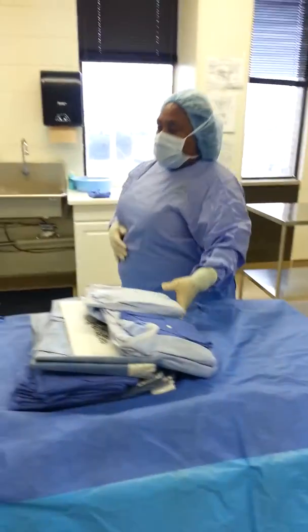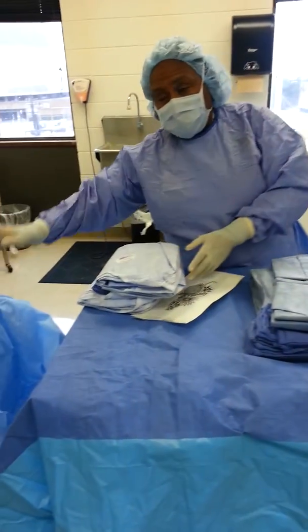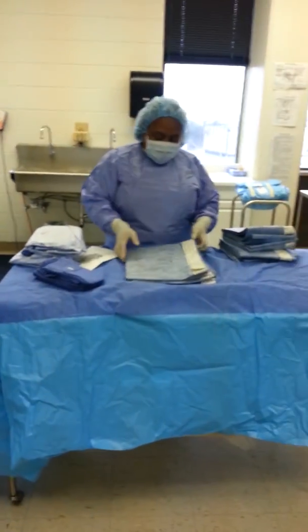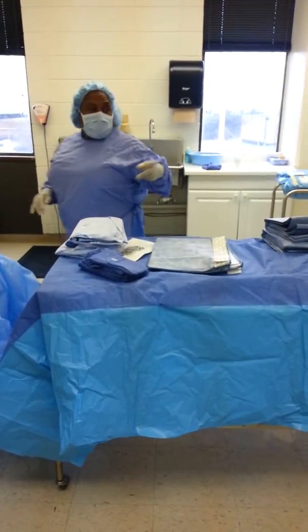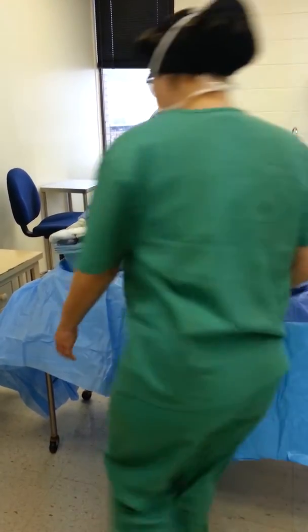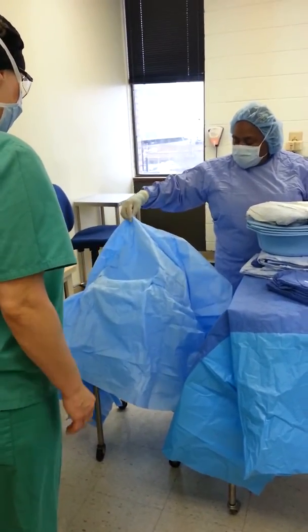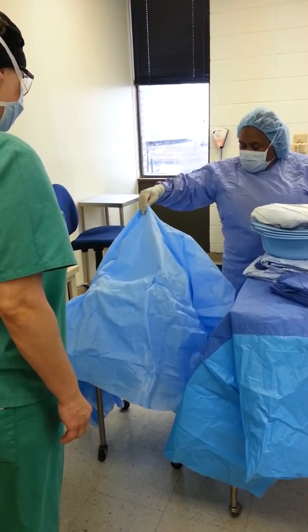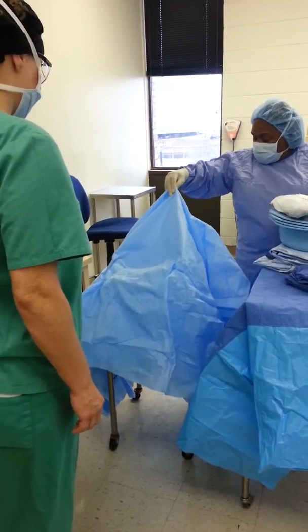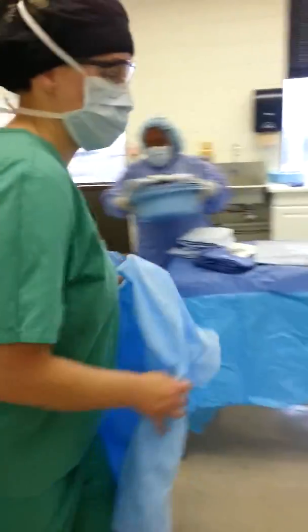Okay? You know what's not in here? All my linen goes at the head, close to the basin. Okay? I don't have a table cover in here. So these are all my sheets. There's one on the bed there. Look, you can take this wrapper. I'm gonna give you one of them. Wait, let me give it to you. Okay. The reason I'm hesitant about it is because I'm bringing what's below up. But I need her to wrap that.